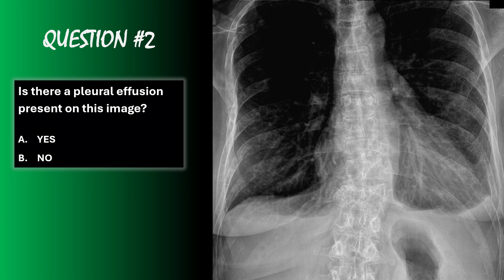Question two: is there a pleural effusion present on this image? Yes — you should be able to see blunting of that left costophrenic angle, which is full of fluid, indicative of a pleural effusion.